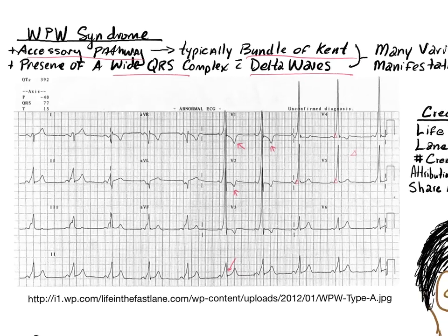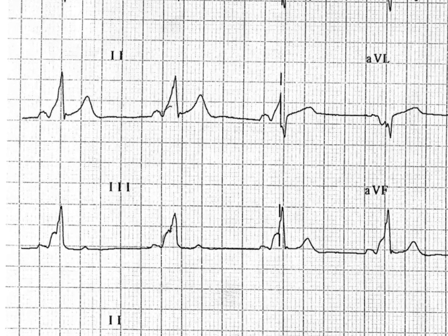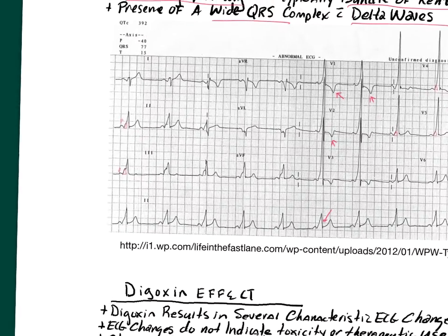Chris, can you go to 2, 3? Sure. Are the P waves always going to be that close? Well, there'll be more separation. There may be, there's a P wave there. I'm just saying, is that interval always going to be that way? Not necessarily, yeah. And look how pronounced the delta waves are here, or look here. Look at that, massive delta wave, huh? Good deal. You guys okay with that?